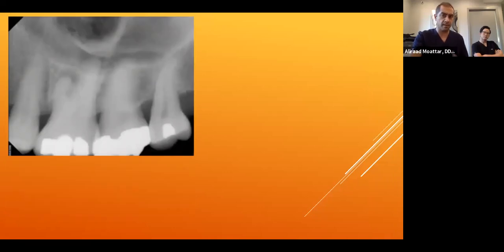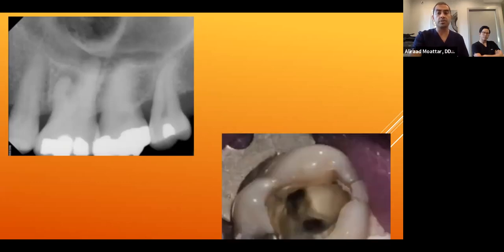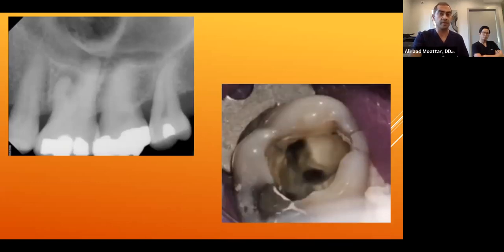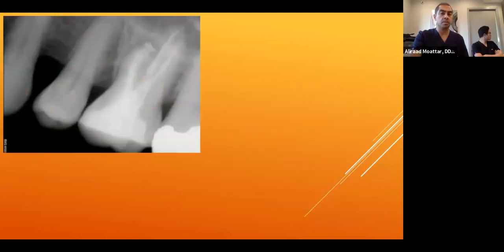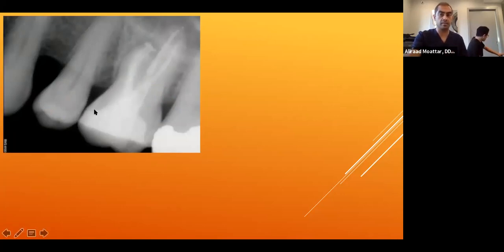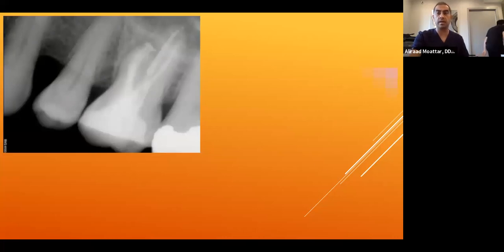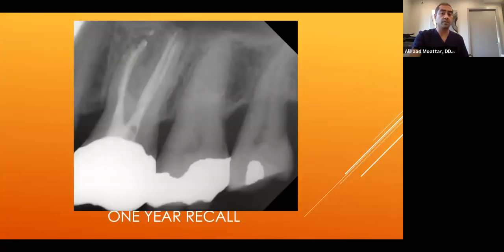A similar case: tooth #14, necrotic with moderate amalgam restoration. Upon access, a fracture line was visible on the mesial. Obturation completed; same procedure — resin penetrated all the way into the crack. On recall, the tooth is still present with proper full cuspal coverage restoration.